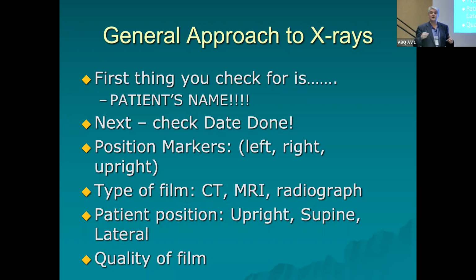Well, in today's radiology and the way that we can store x-rays and pull up x-rays, you want to make sure that you're looking at the most current x-ray, because a lot of times you can compare it to the times in the past. And again, you might get your days mixed up. So make sure you're making it on the appropriate day, person and the appropriate time.